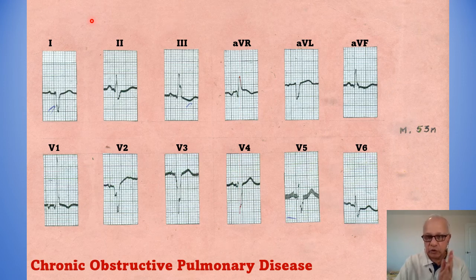This is something which you are deducing. I have discussed this in the discussion on QRS axis. So you now have to add 90 degrees to 45. To which side? To the right side, isn't it? So 90 plus 45 will give you 135 degrees to the right. So it is a very significant right axis deviation of 135 degrees, right?